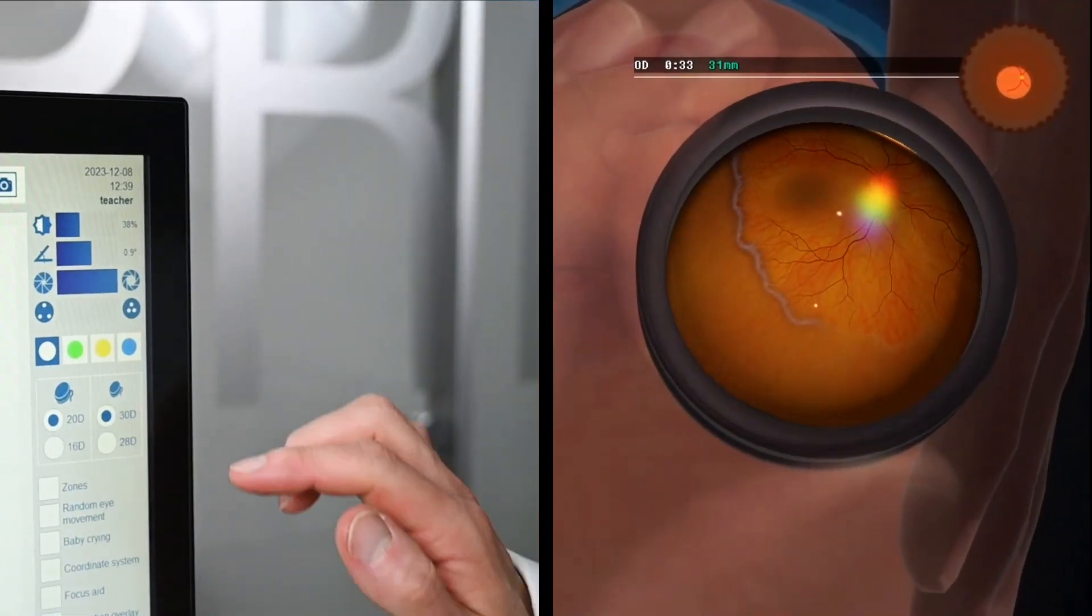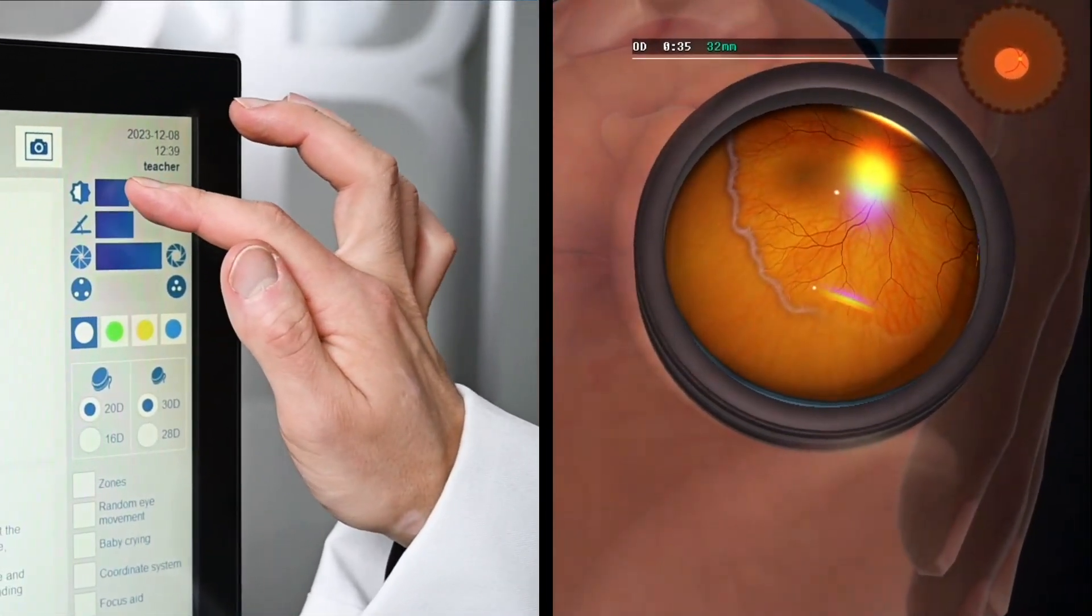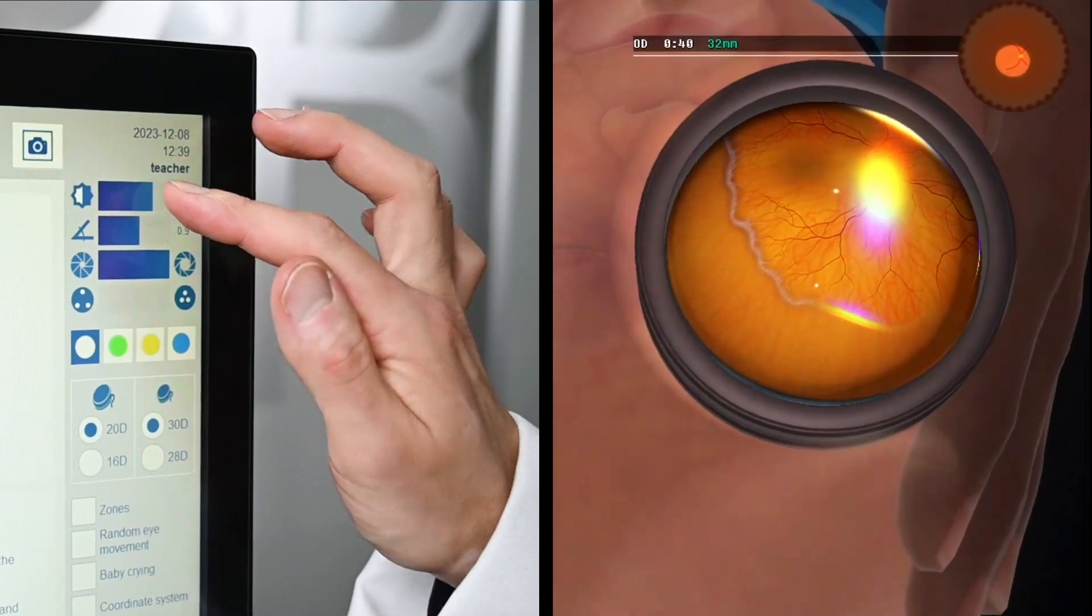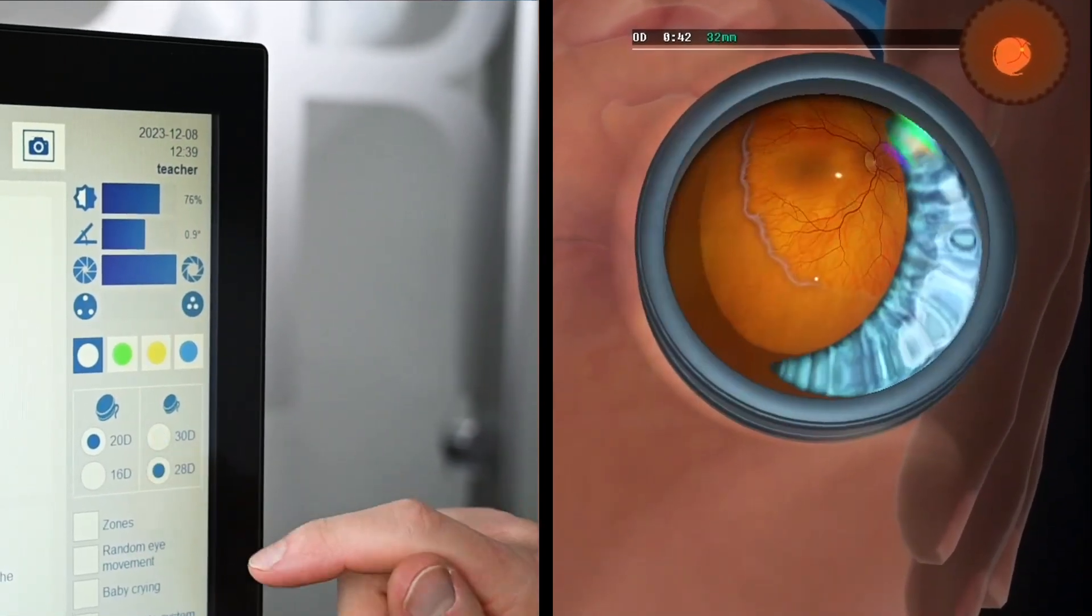On the touch screen, trainees can control the indirect ophthalmoscope settings, for example, light intensity and lens magnification.